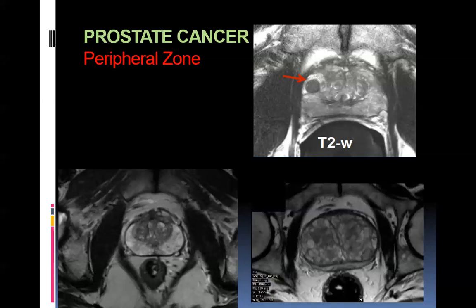So whenever you are scanning the prostate gland, you try to see if there's any lesion inside the prostatic part. This is when you're doing ultrasound, and usually we do a transrectal ultrasound because it gives you more detailed images. But the imaging modality of choice is going to be MRI. Why? Because these days we are doing multi-parametric imaging. So what is multi-parametric imaging? Actually, we're making use of diffusion weighted images along with post-contrast images to see these lesions. We have the PI-RADS classification, like you have BI-RADS classification in breast cancer. We also have a PI-RADS classification for prostate lesions. And according to that, then obviously we try to figure out what stage it is.